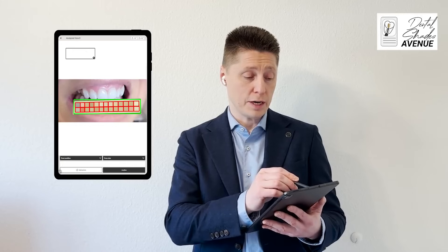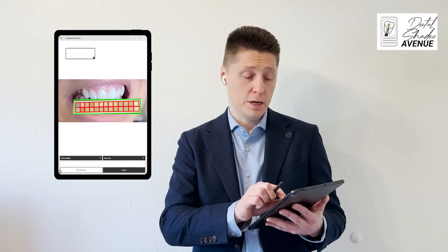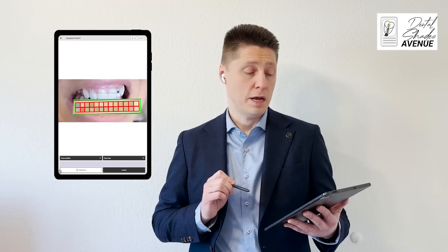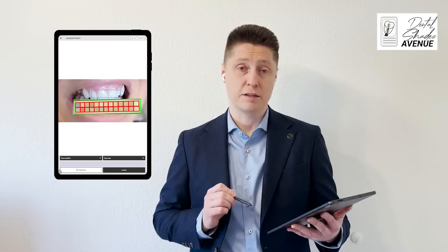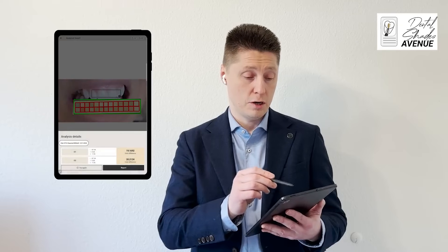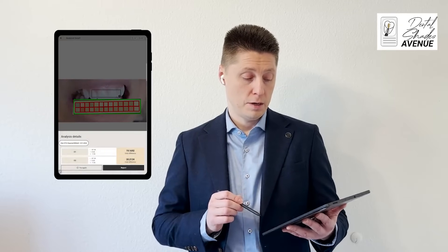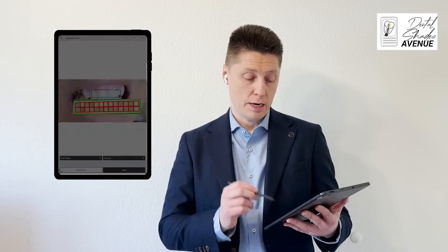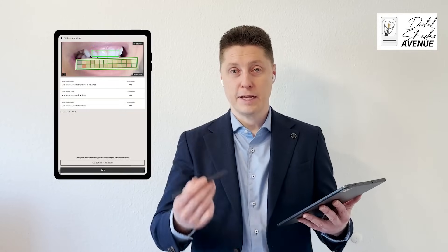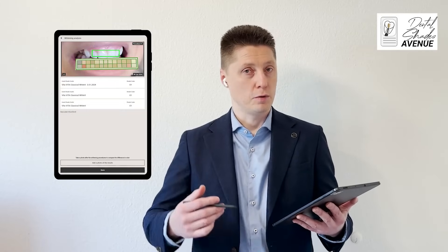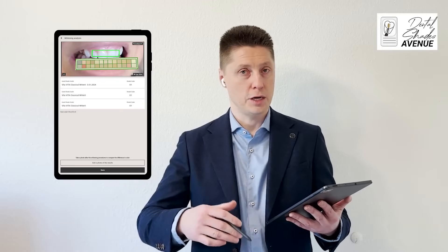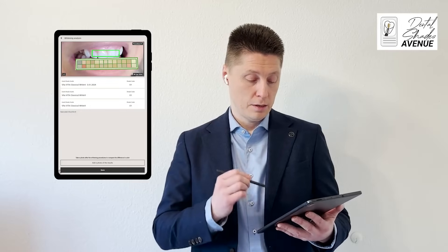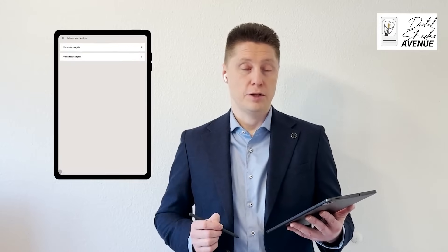So we have now already here — you can see that we have the right angle — we can position it on the area we would like to measure and we click Define Color. The software will give us two measurements, two closest measurements, and I can click Report and save this report in PDF format. I can share it with the laboratory, with the patient, or I can save it in my file structure. Save, and here you go.